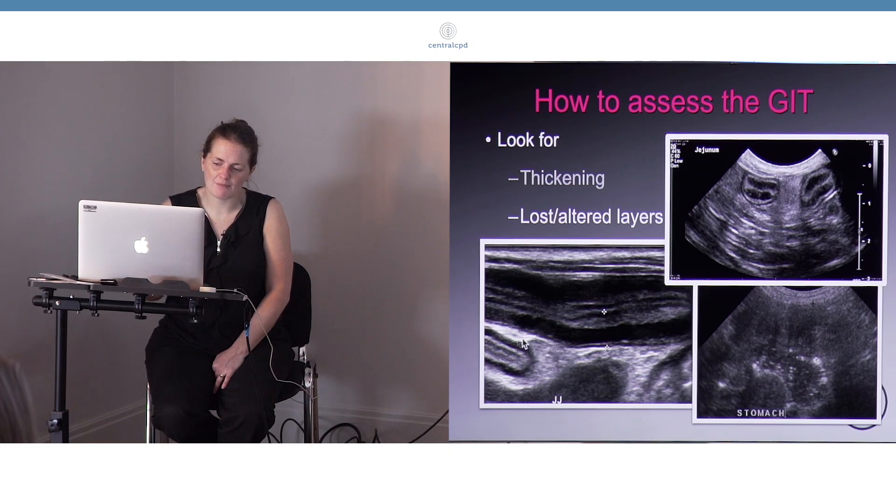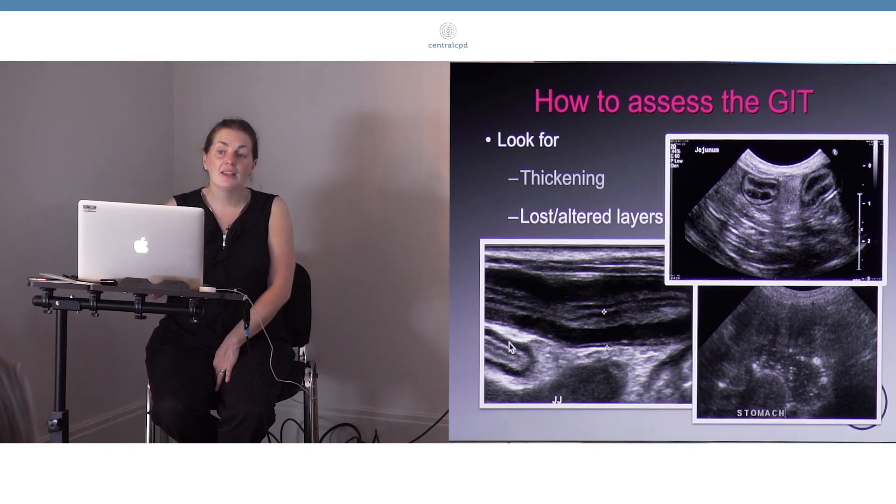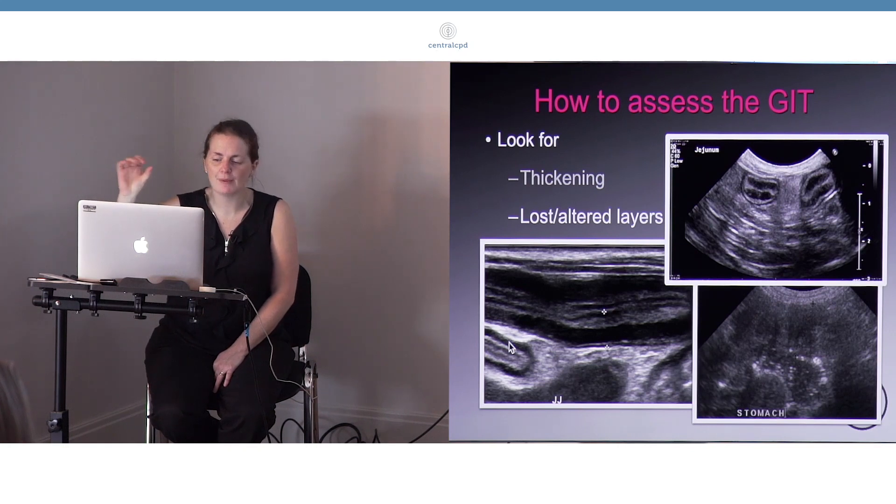We see that even better when we see it in cross-section. We'd normally expect to see this layer being thicker than this layer, and there are actually now published values of the proportions of the bowel wall that we would expect. Actually, it's a subjective thing. I think in the small intestine, if the mucosal layer is thinner than the muscularis layer, that would be abnormal.